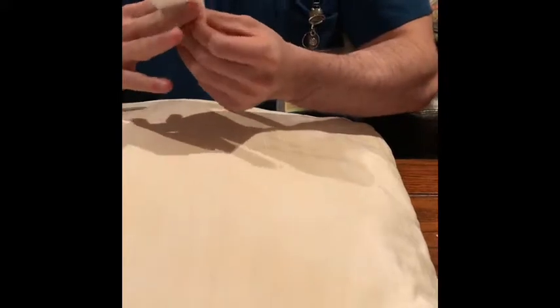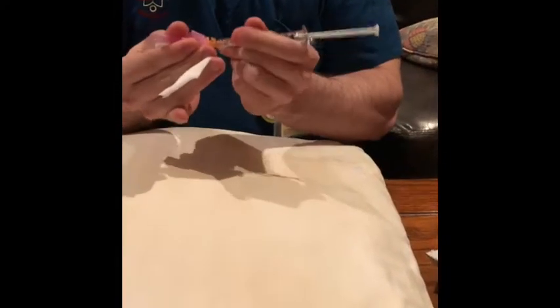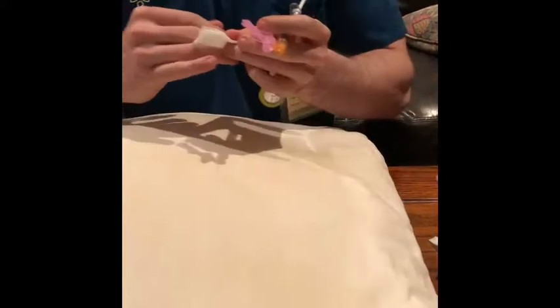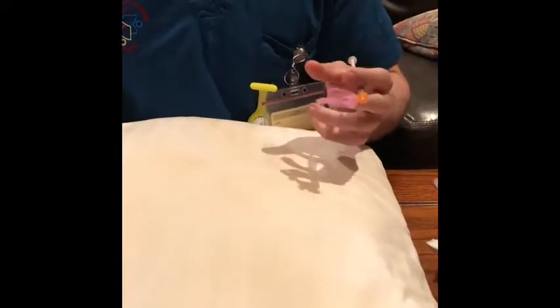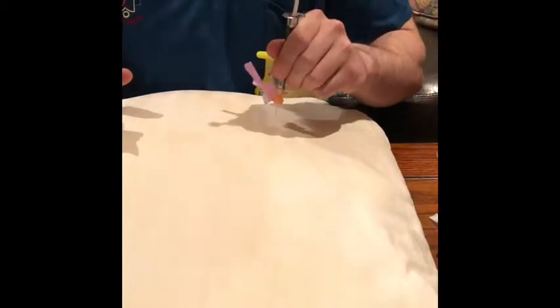And then when preparing for the administration, you would take the gauze and put it between the fingers of your non-dominant hand, like so. And then grab the actual syringe. And then as it is a subcutaneous needle, I'll be coming down on a 90-degree angle. If the patient had less body fat around his abdomen, I would go at a 45-degree angle, but just for this case, I'll be coming down at a 90-degree angle. So I'll come in like a dart.